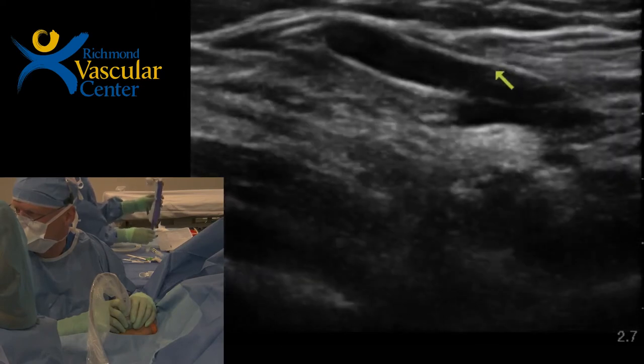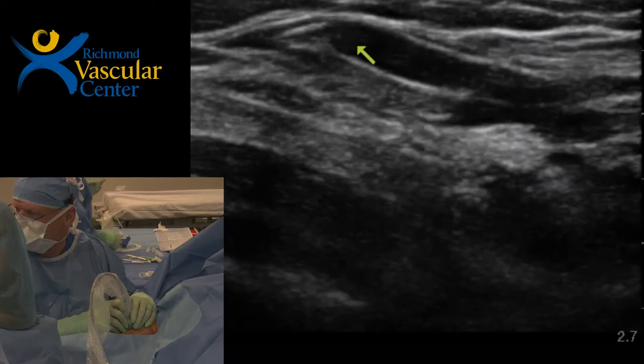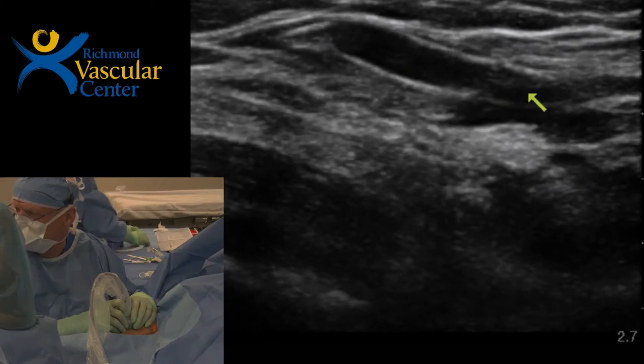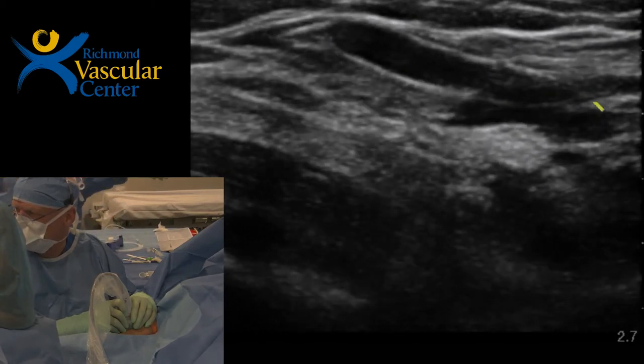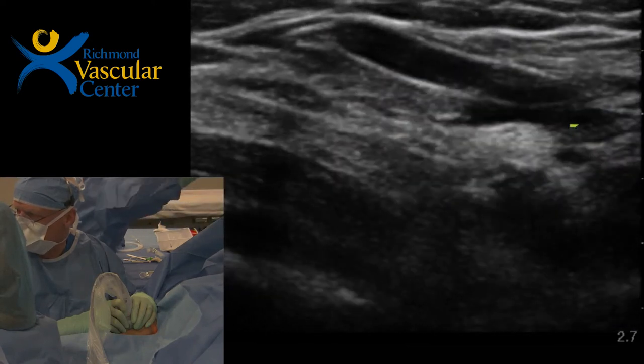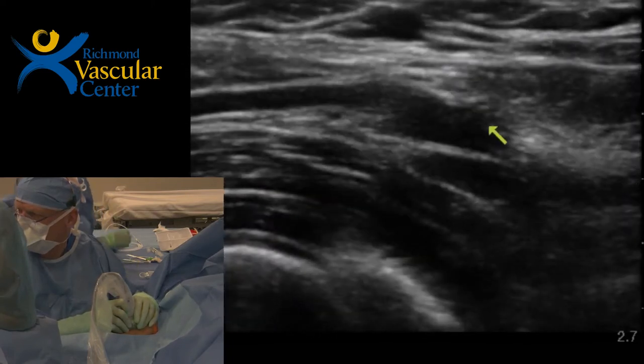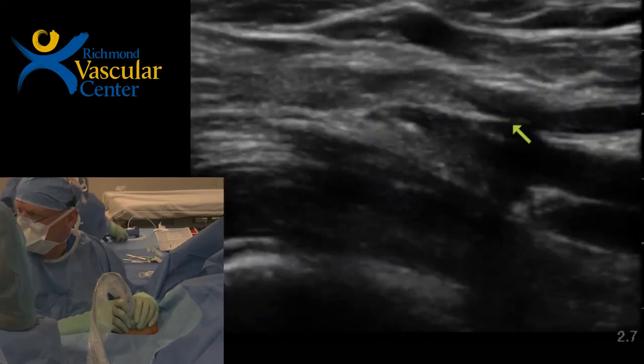You can see, show the arrow to the left. Okay. So that's the start of the perforating vein. And it comes down, goes into the radial vein. It sits right on top of the artery, which is right there. So the question is, the perforator looks nice and straight and comes down right on top of the artery.